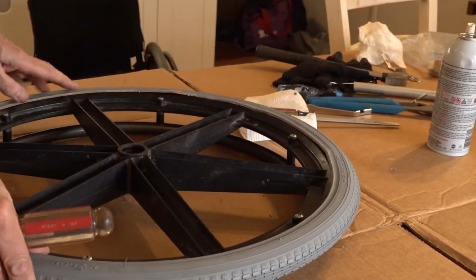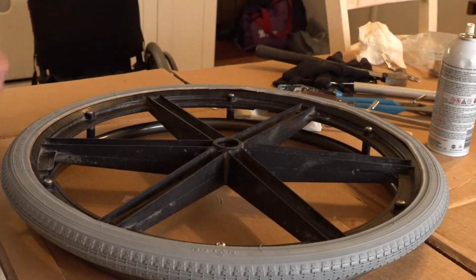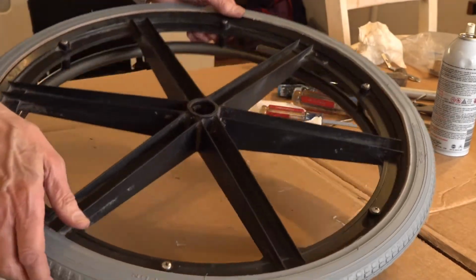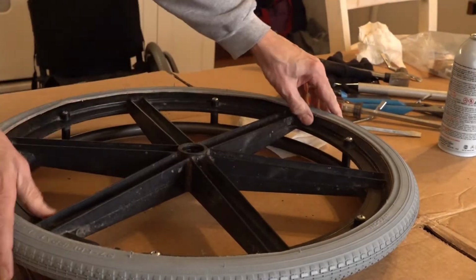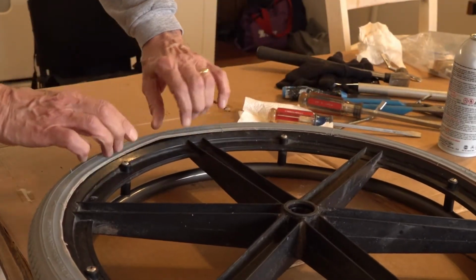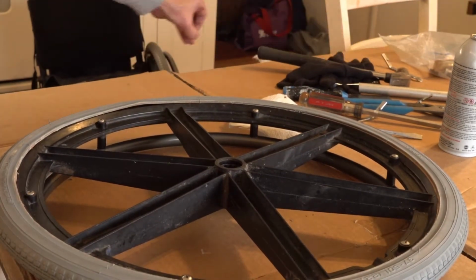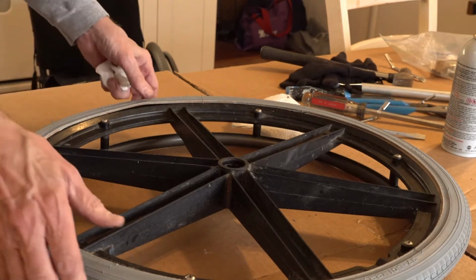Okay, now, that was the easy part. Getting the inside rim in, the insert in. Now we have left the outside edge of the tire still needs to be inserted. And that will go in just as you normally would for a regular bicycle tire. Just gotta strong arm it in.